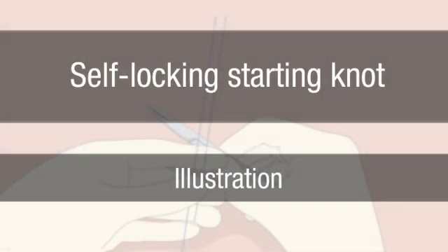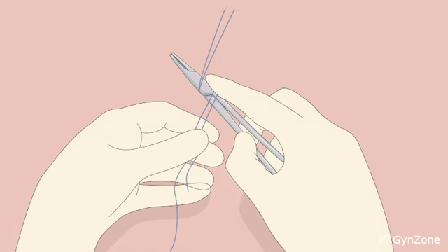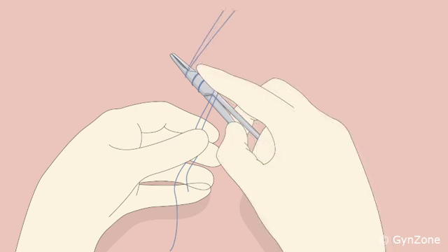Here you can learn how to tie a self-locking starting knot, also known as a Duncan knot. The illustration shows how holding the needle holder beneath the two parallel threads makes the knot. The needle holder is wound around both threads once, twice, 3 times.